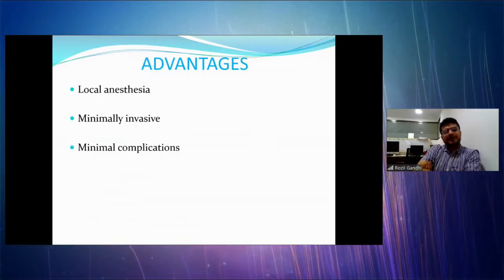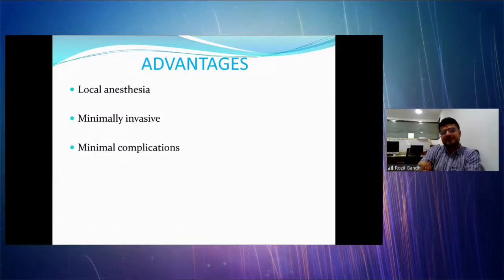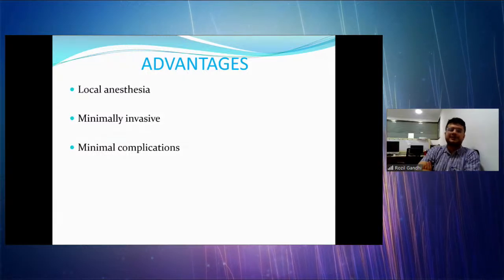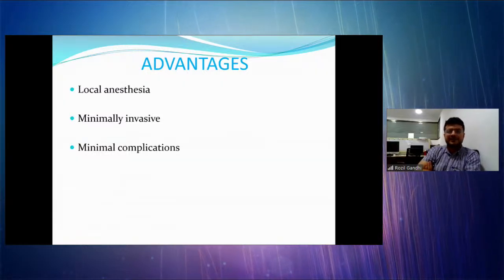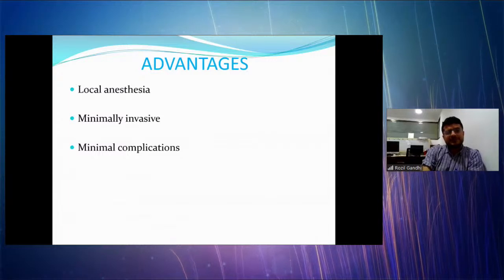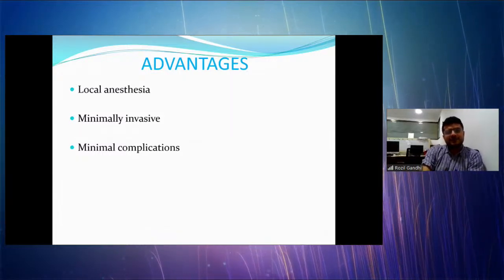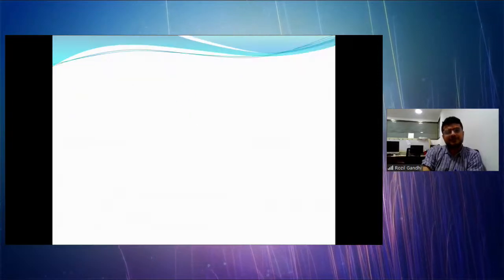Advantages are that it is minimally invasive, with minimal complications, done under fluoro guidance in the cath lab. The first puncture is done under ultrasound guidance. This is how the biliary duct puncture is done. It is done under local anesthesia, so there are no complications of anesthesia also.